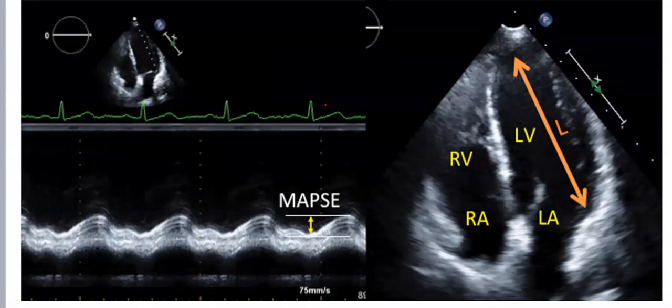Which one do you think is higher in terms of peak distance? Now the TAPSE, we said the threshold of normal is 17. Do you think MAPSE is supposed to be more than that figure or lower than that figure? More. Lower, yeah. Because the RV, by the way, is more vigorously contracting at the annulus than the LV. So the normal MAPSE is lower than the normal TAPSE. Okay, here it's 12, 14, there it's 17.